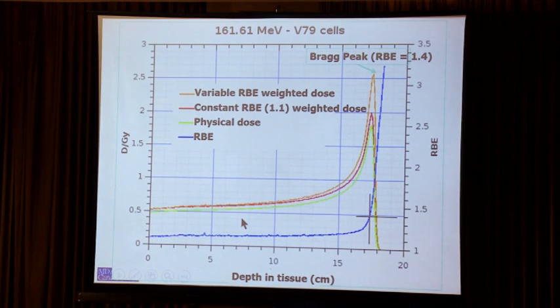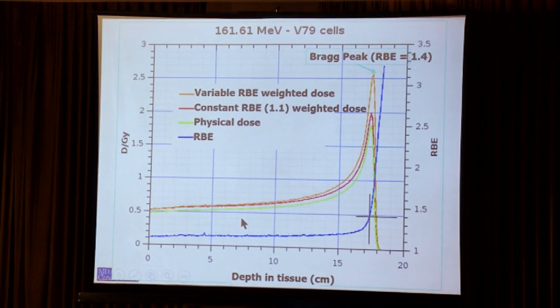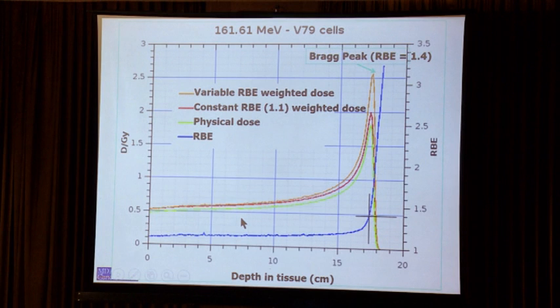And then when the results are not better for the proton, we say, we don't know why not, but I think this could help make protons even better than they have been so far. But the tools are not yet available. We are doing research. We're trying to create systems. I wouldn't be surprised if within a year or two, commercial vendors have adopted this and they're able to create plans with this methodology.